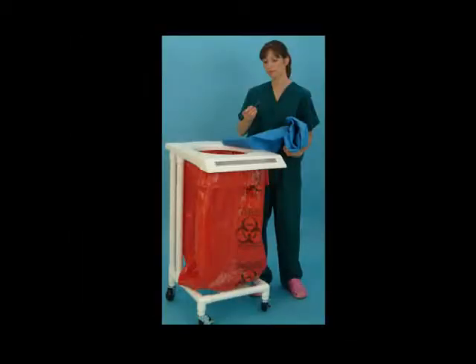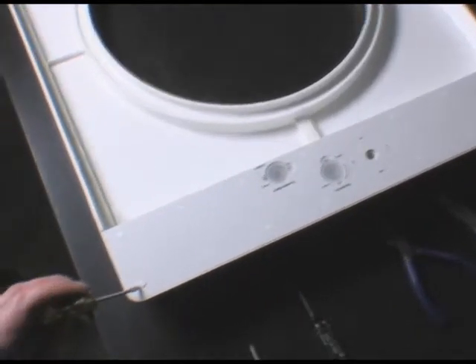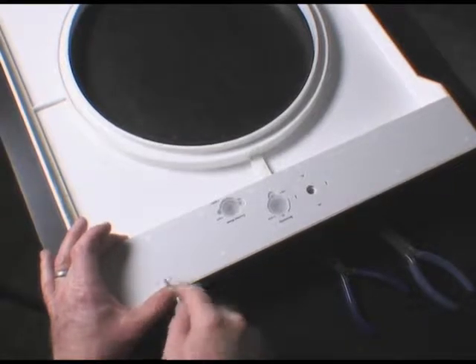Guardian OR Instrument Detector Replacement Parts Removal and Installation Instructions. The Guardian OR electronics are housed inside the front section, accessible from the bottom of the device. Access to the device's electronics requires removal of the bottom housing panel.